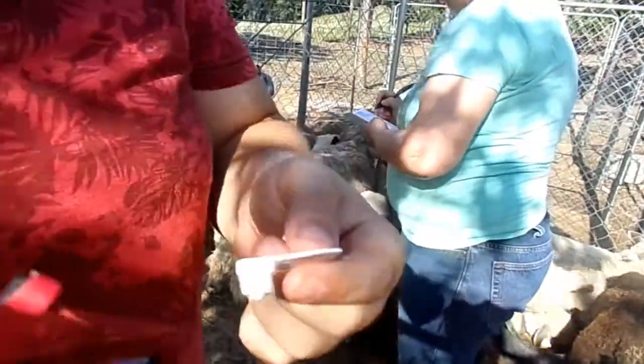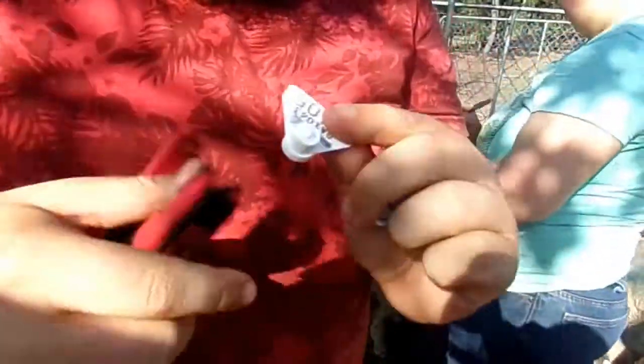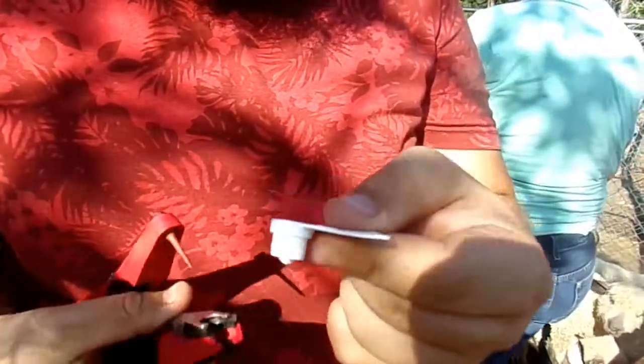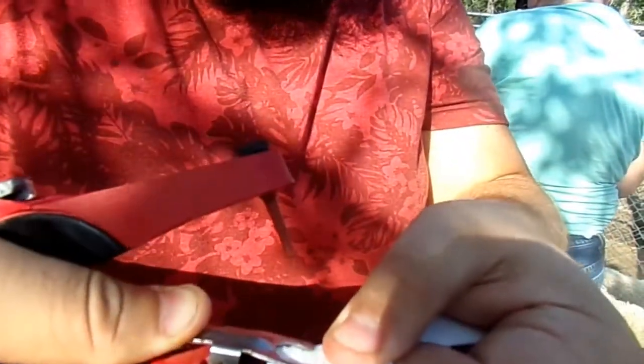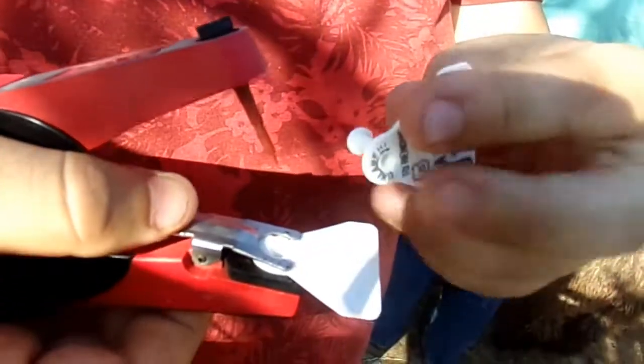So to install one of these tags, you take one end of the tag and it slides in and clamps.